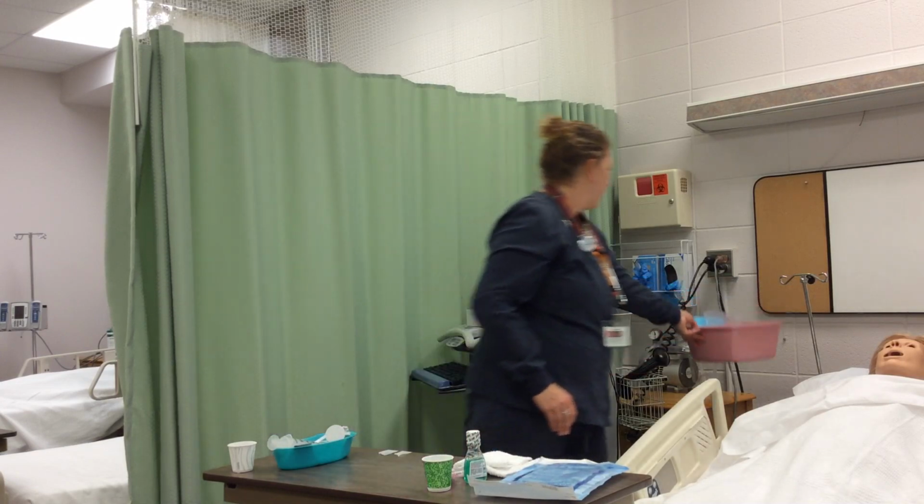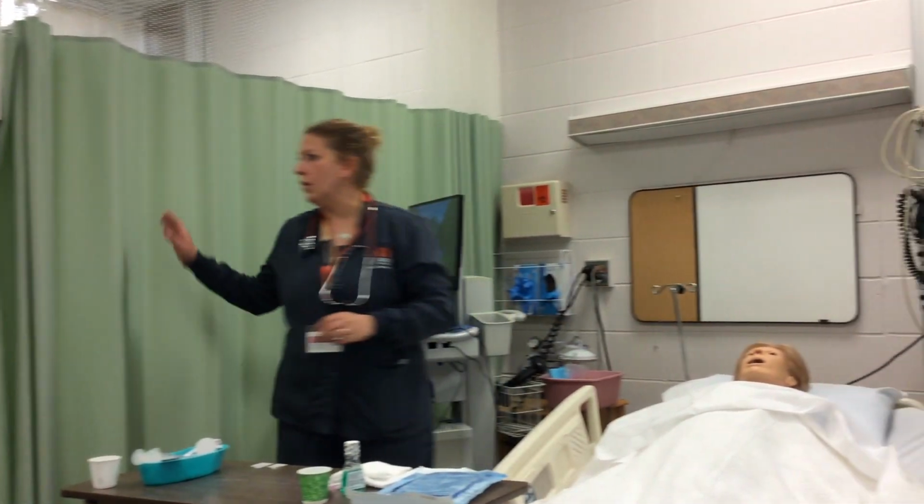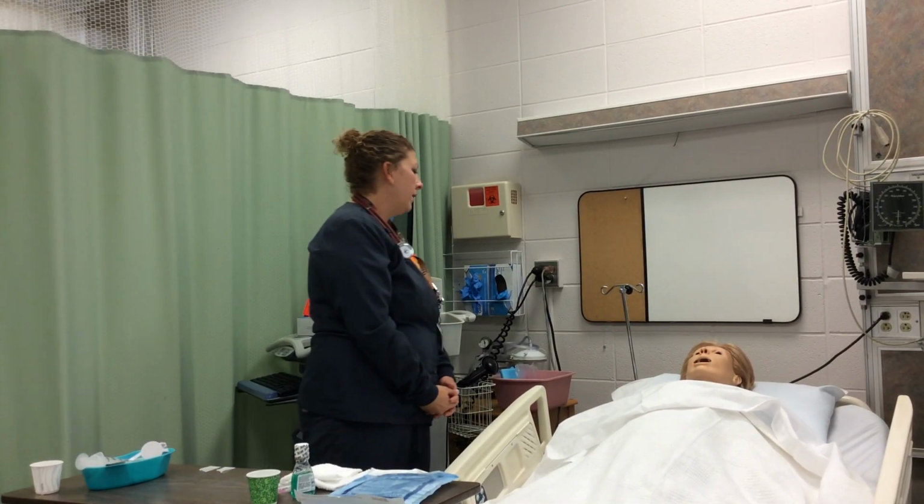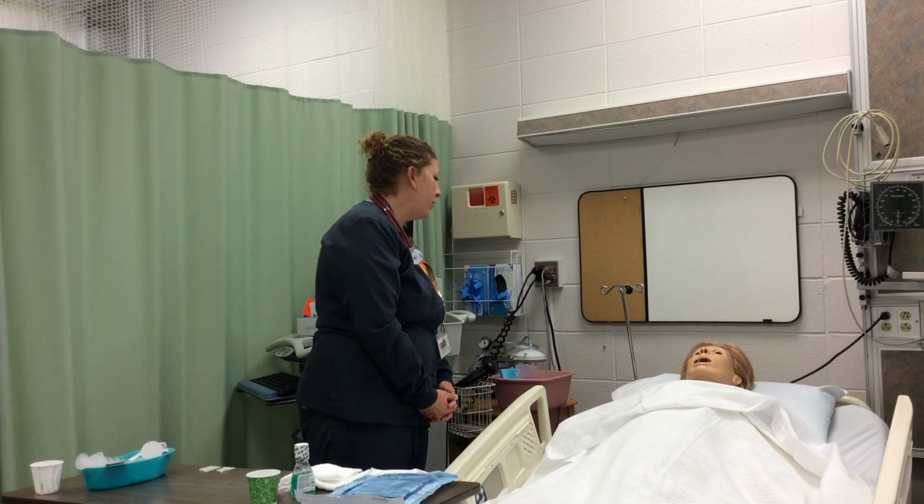Provide for the patient's privacy. I'm going to pull your curtain for privacy. Introduce yourself to the patient and family, stating credentials. Hi, I'm Sarah. I'm your student nurse.